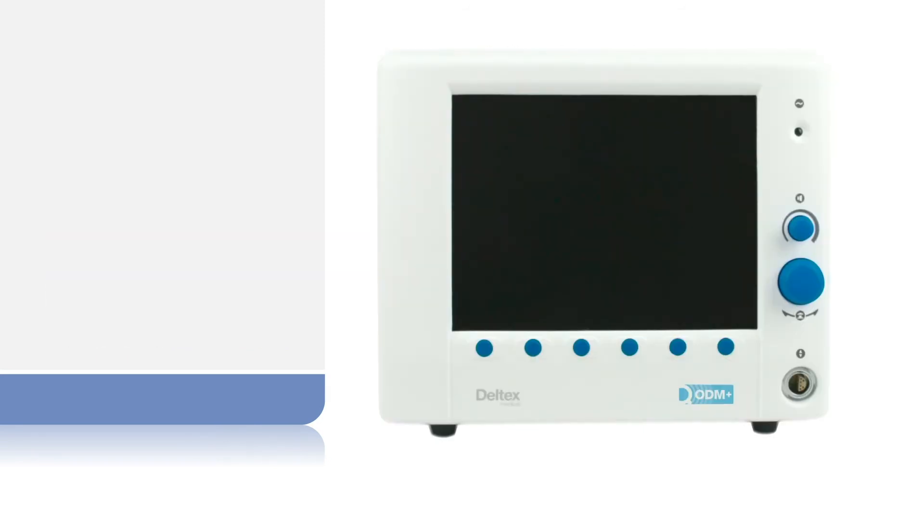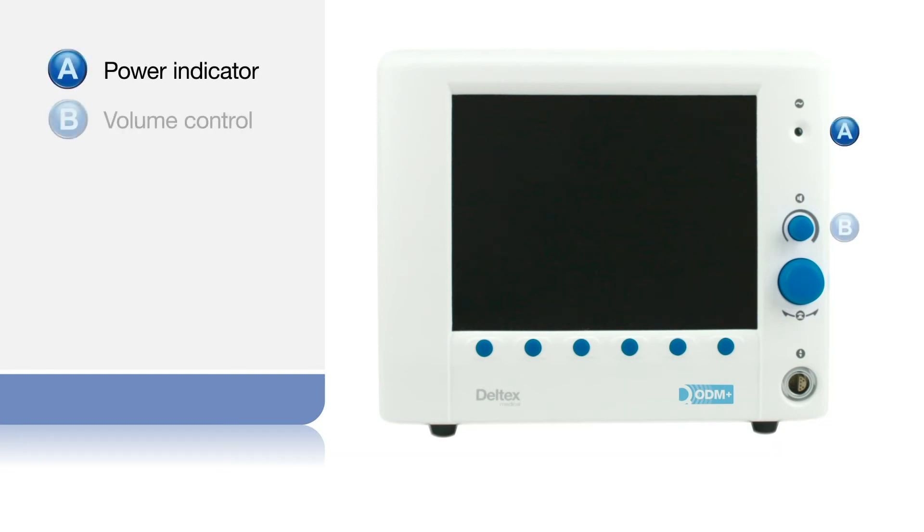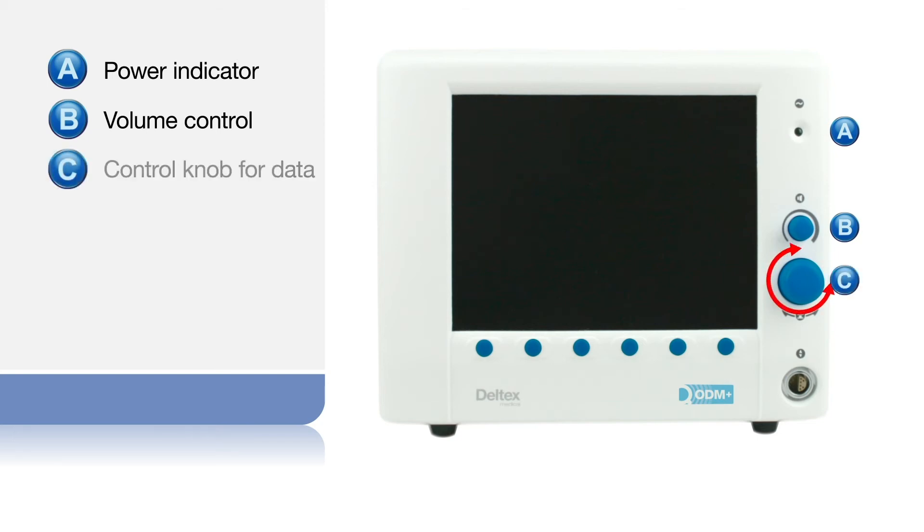On the front of the monitor are a green light that illuminates when the power is on, a small volume control knob, a large control knob which rotates to change and select parameters such as age, weight and height, and can be pressed to confirm a function. On some screens it can be used to select functions appearing in a lighter colour.